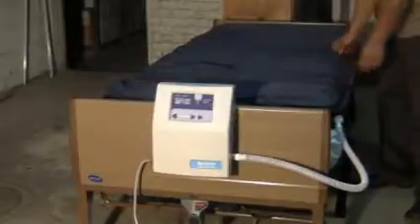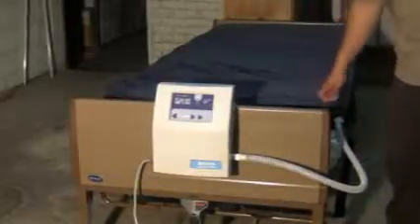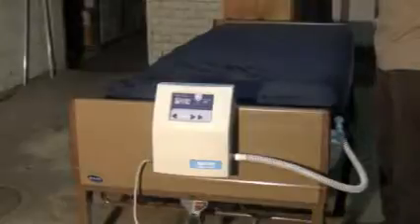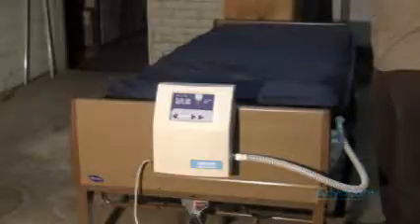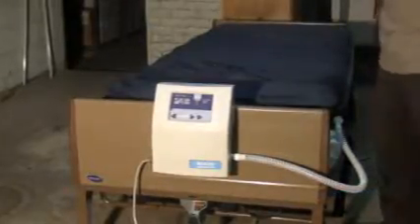If your Plexus low air loss overlay top sheet does get soiled, you may clean the top sheet with a mild soap and water solution. You may spray it down with a spray bottle, wipe it with a damp cloth, and dry it with a dry cloth. Please do not use any bleach or ammonia on any of the top sheets.